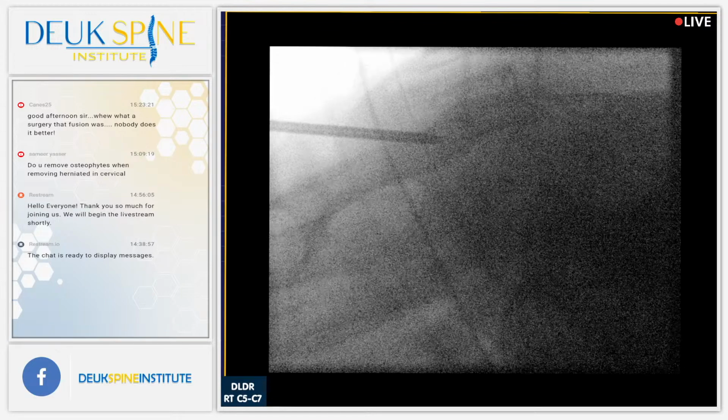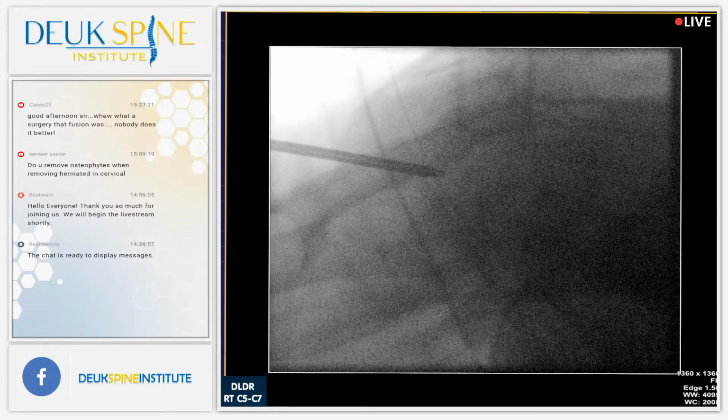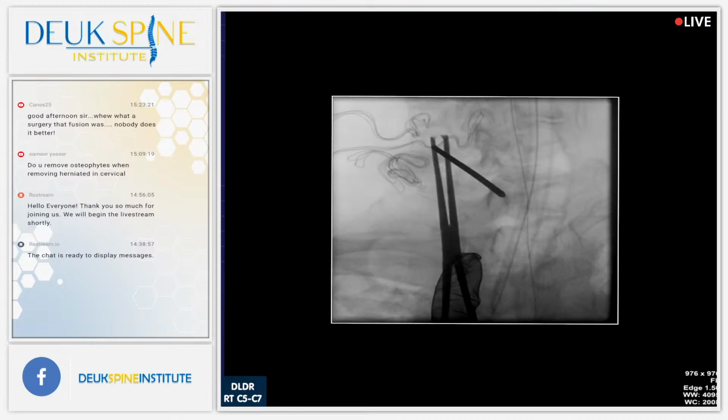Shot. Just about there. We can just get a tiny bit more. Shot. I think we're there. We just got to now see where we are in the AP. So everyone stay where you are. Don't move. Man, that's really hard. I don't know that I can get that. I'm going to try. I'm feeling a lot of clavicle resistance.